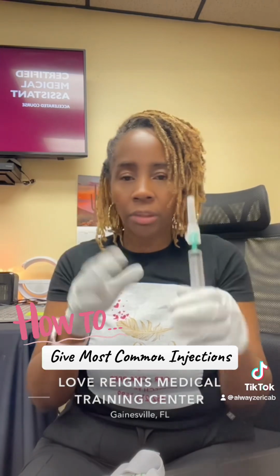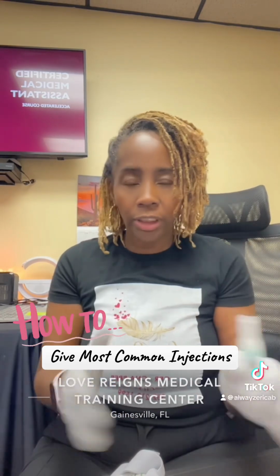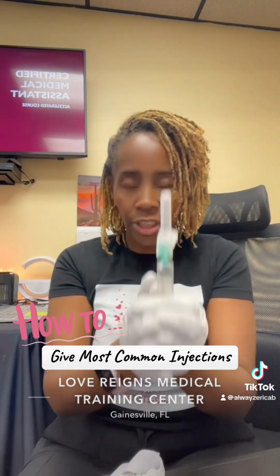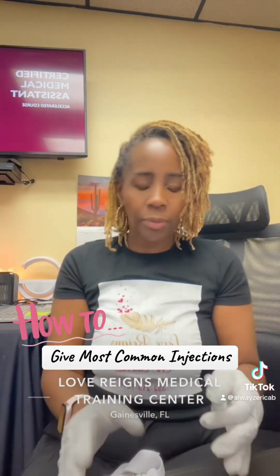is I'm going to have all my gloves. I'm going to check my order. I'm going to do all the stuff. Y'all understand that these would have been 3 different patients, so we would have washed our hands and all the things. I'm just kind of showing you each injection with the same gloves on, but you would not be using the same gloves. I hope we're clear on that, okay?